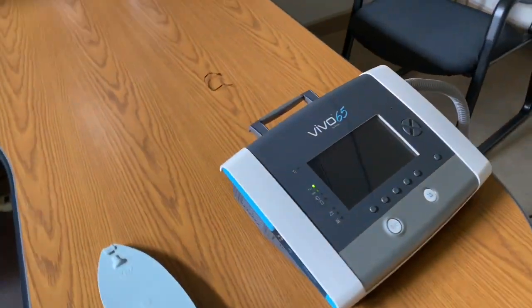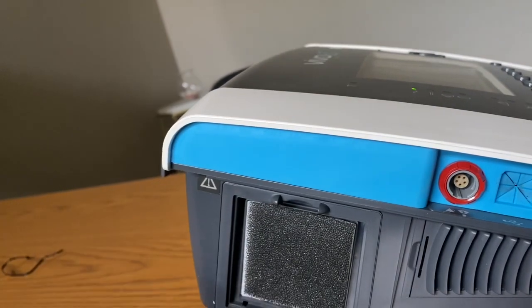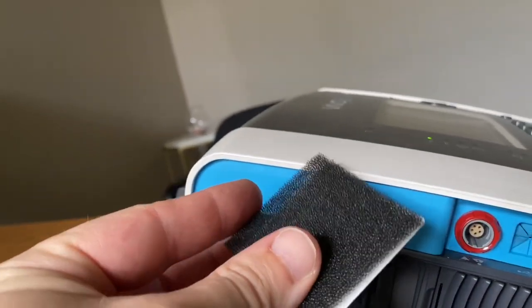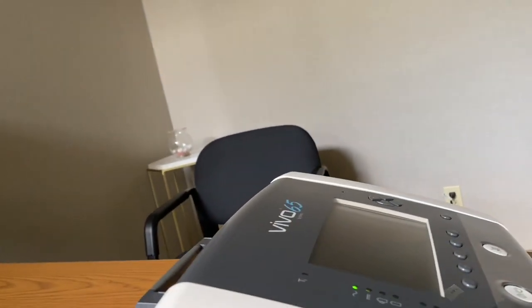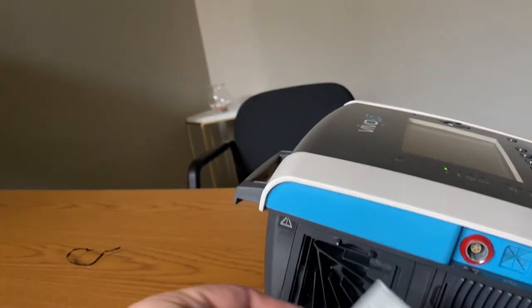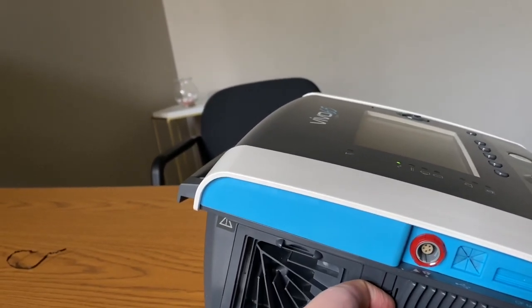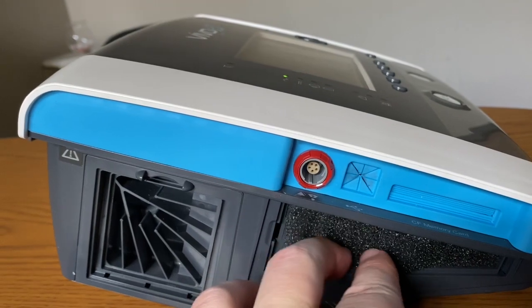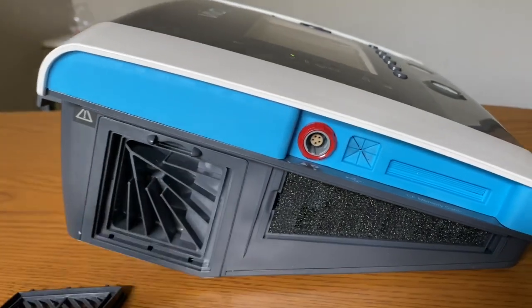As far as maintenance on the ventilator, there is a spot for filters. This little window pops off here, exposing a foam filter that captures larger dust particles — it can be carefully cleaned and rinsed with water. There is also a smaller HEPA filter that captures smaller particles; it cannot be cleaned and just needs to be replaced every so often. There is another filter exposed here that can be checked and cleaned periodically — just make sure it's free of any obstructions. That's protecting the actual computer, and this is going to the blower right here.